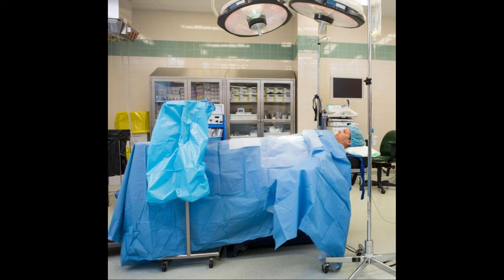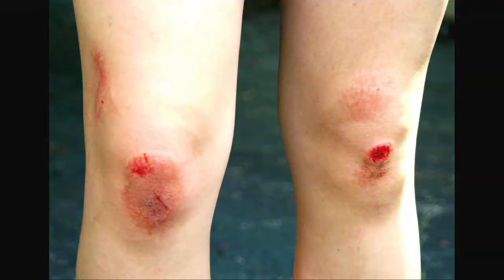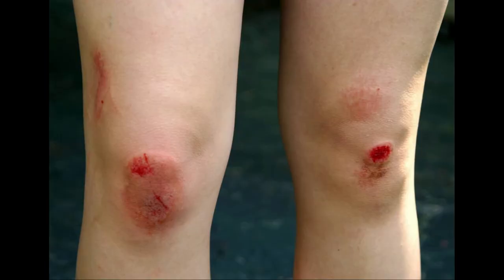Some syringes can be fitted with tips to lock onto catheters and other syringes. Others can be attached to trocars — short tubes with sharpened edges designed for insertion into the body for procedures like liposuction. The Toomey syringe can be used to carefully control the amount of material removed from the site, with a lock to keep the contents in the syringe.